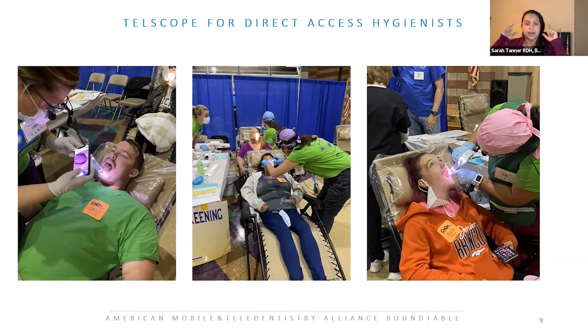So I was able to use my magnifiers, my loupes without the light, and the illumination from the TelScope was amazing. It just illuminated the entire oral cavity. Pictures were taken of lesions. We would tell the patients, hey, no news is good news. We're going to send these over to the oral surgeon in a HIPAA compliant form. Your information is secure, safe. That's also an important thing for me in my practice, is just making sure that I'm staying within the barriers of being compliant and safe, not only for my patients, but for everybody. So we sent those off.